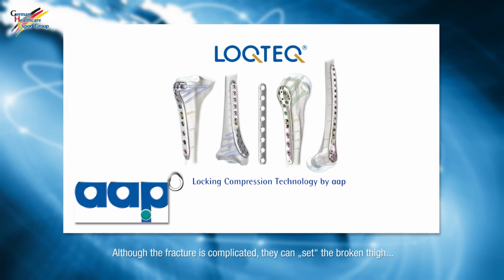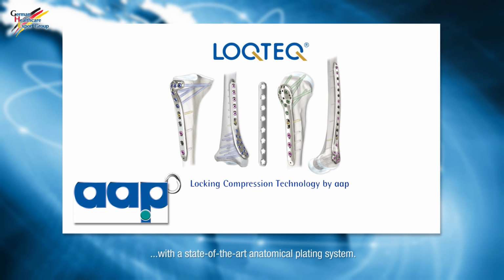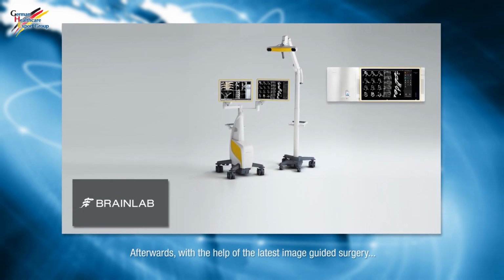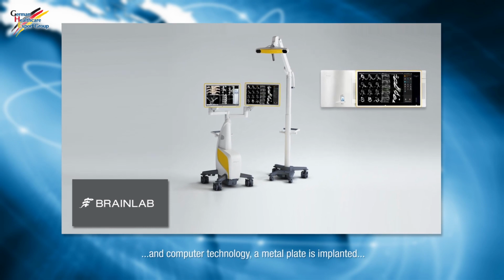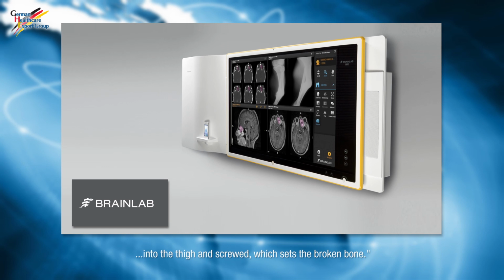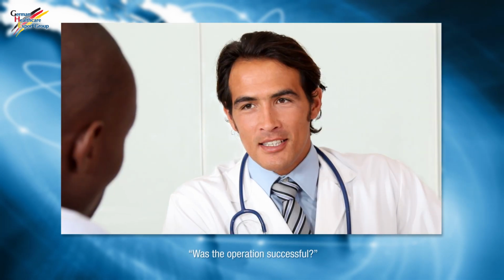Although the fracture is complicated, they can set the broken thigh with a state-of-the-art anatomical plating system. Afterwards, with the help of the latest image-guided surgery and computer technology, a metal plate is implanted into the thigh and screwed, which fixes the broken bone.